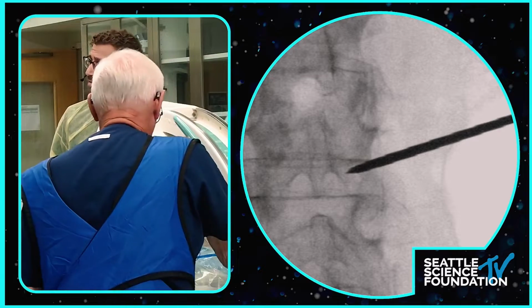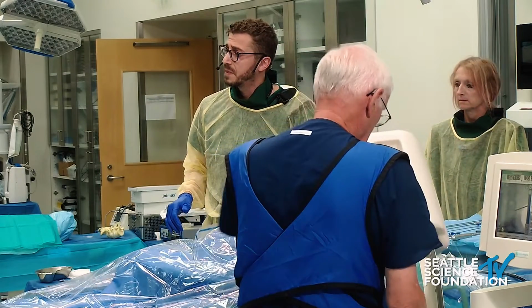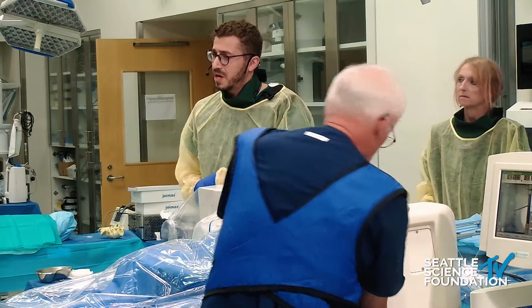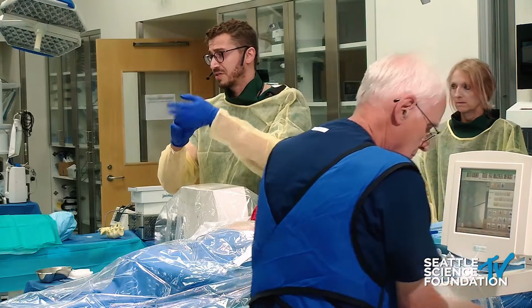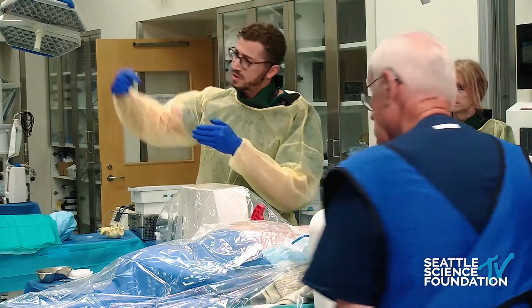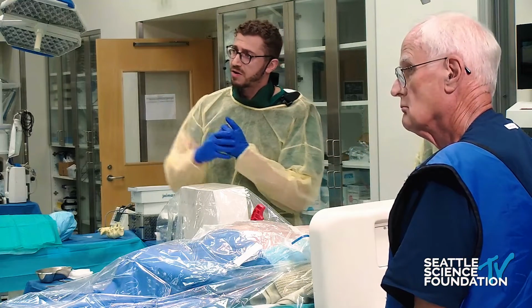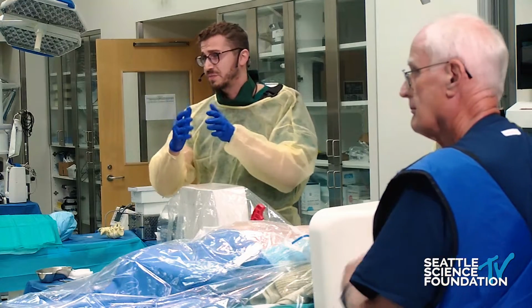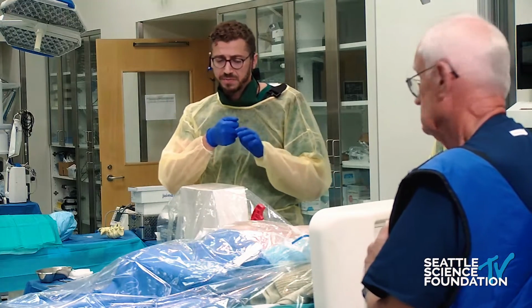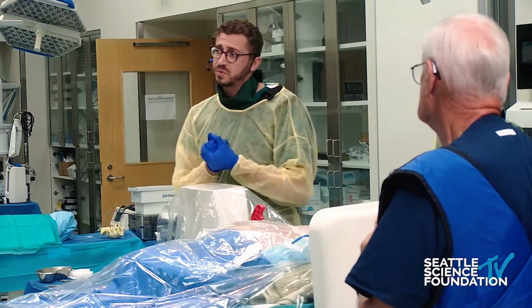Osama, on that, did you change your trajectory if you have an inferiorly or a superiorly migrated disc? Anything like that? In my opinion, you go for where your lesion is. So if your lesion is inferiorly migrated, you want to start a little bit more cranial to go more caudal. If your lesion is central and at the level of the disc space, you can get your angle to be more flush with the disc space. So it really just depends.